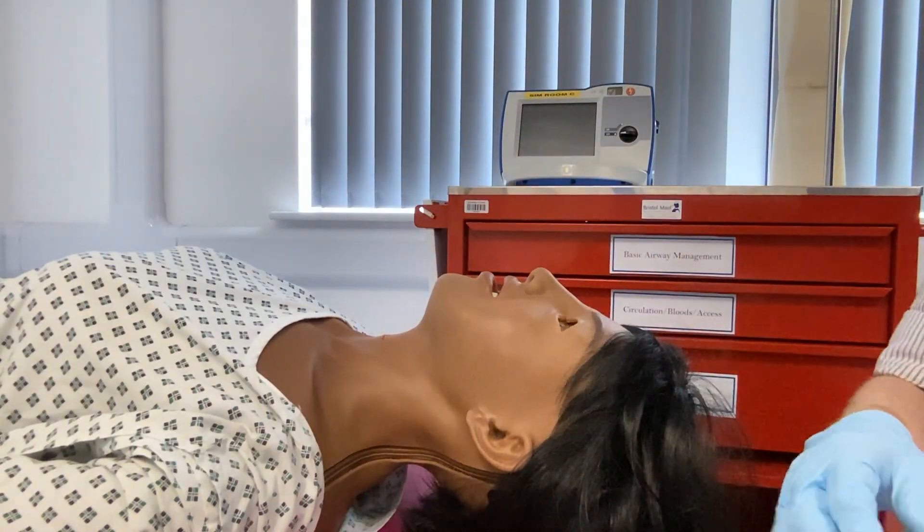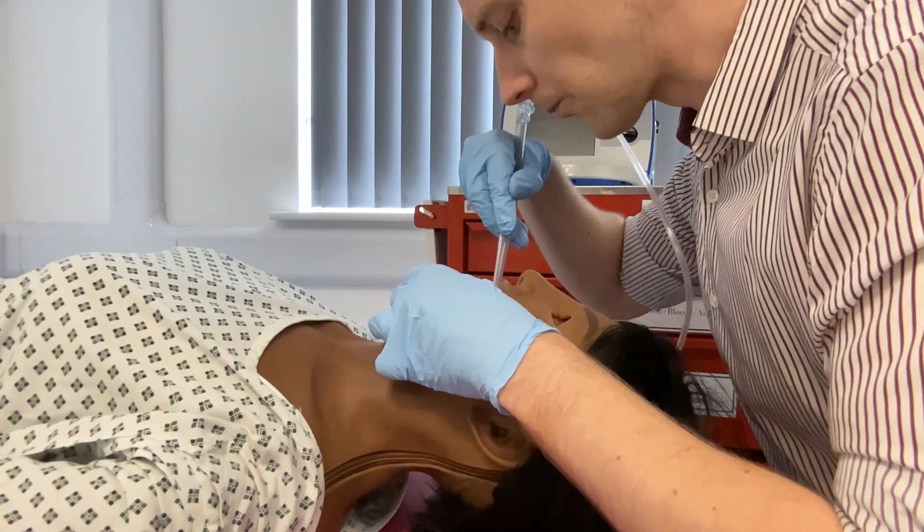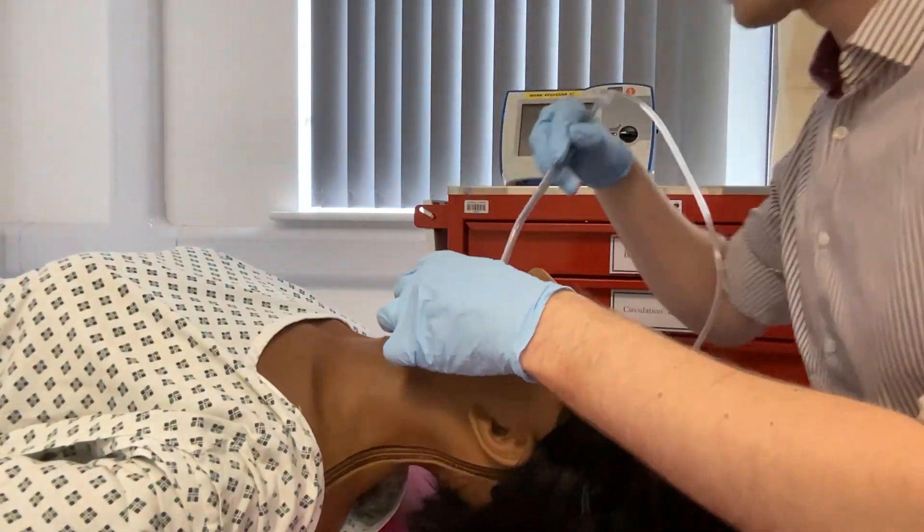Make sure to turn the suction on at the wall or the portable device. Ensure to open the mouth and only suction what you can see. Do not blindly suction lower down the airway.